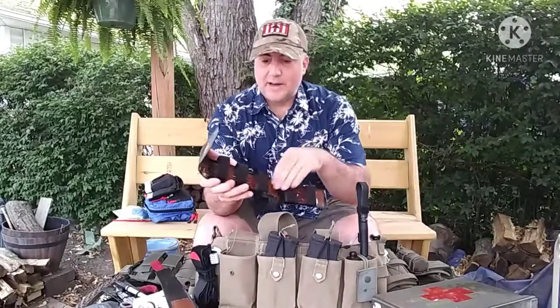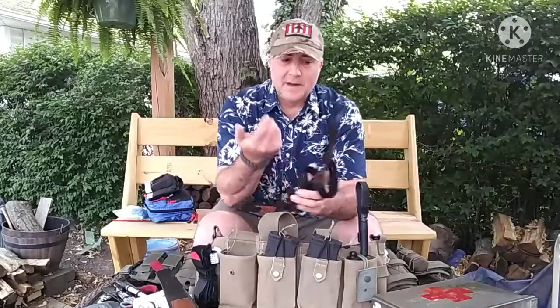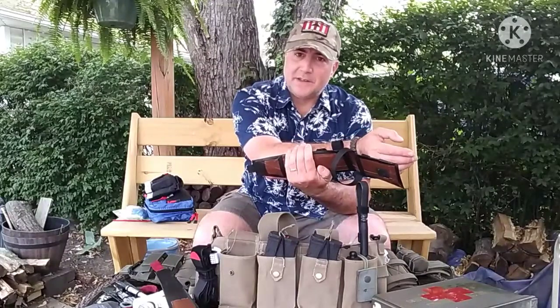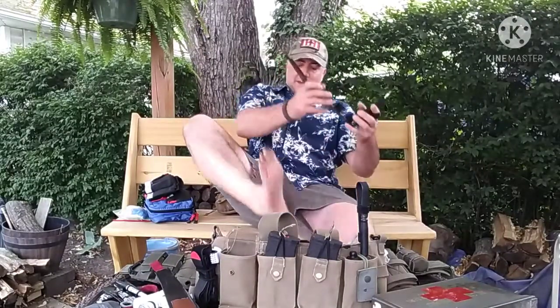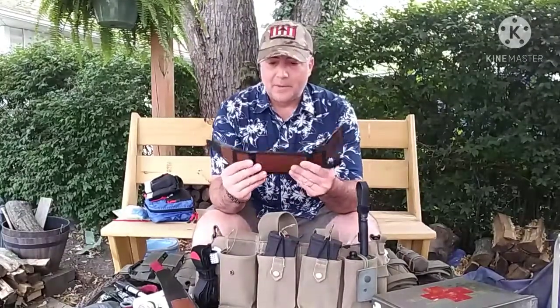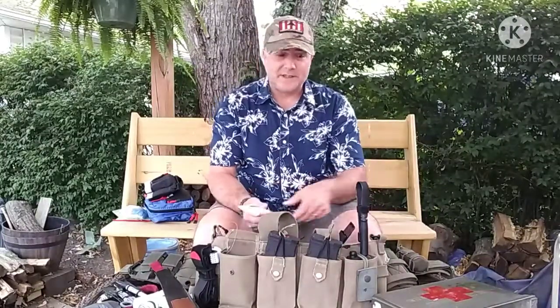On this specific one here, I used larger elastic bands for securing things. But to take that and hold somebody's arm in place that's been broken, or a broken wrist, or a broken leg, or a broken ankle, this is nice because you can use this to secure all that if you needed to, and it works really, really well. So I've been making these for a while now. They're quick and easy to make at home, and that works out really good for those inserts for your IFAKs.